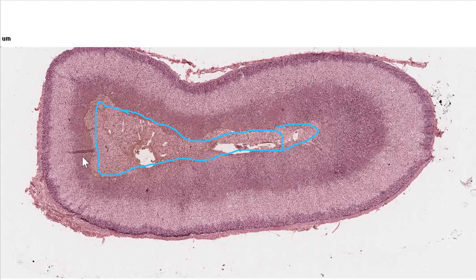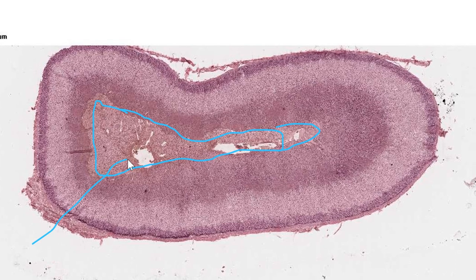If your teacher for your practical has a pointer pointing right here and they say, what is this structure? That would be your key to say medullary capillary, right? If it is listed as, what is this region? That would be your key to say the adrenal medulla, or the medulla of the adrenal gland. However you want to put it is fine.